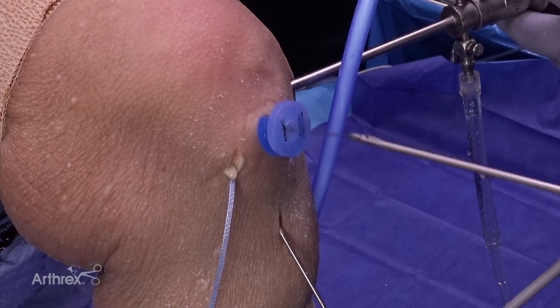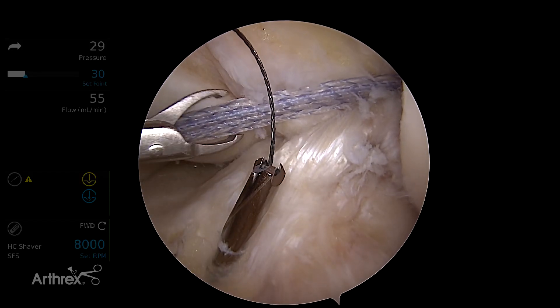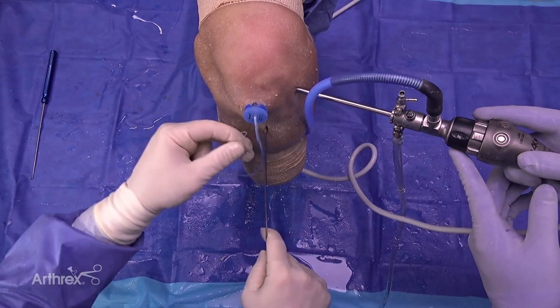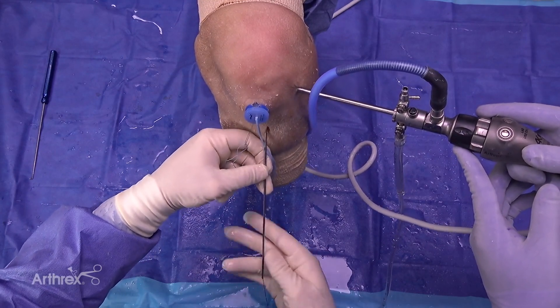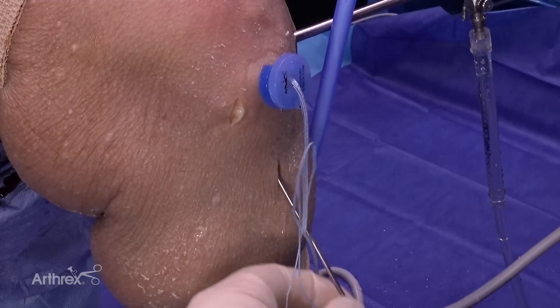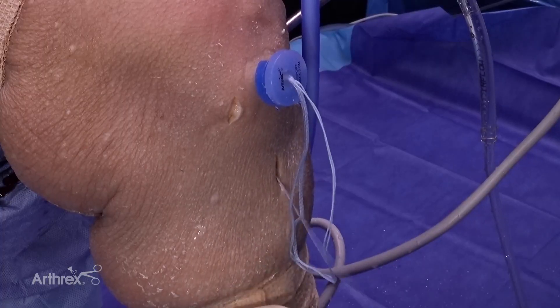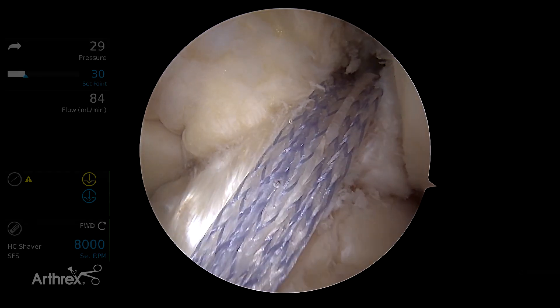Now we're going to advance the nitinol wire out the passport cannula, grab our fiber tape and bring it out with us. Before we advance the fiber tape, we back up the drill pin by hand — pull it back down so we don't get our wire tangled on the teeth of that drill. Pull the drill pin out by hand, then pull the wire through. You can see the fiber tape coming down and tensioning up along the ACL nicely.